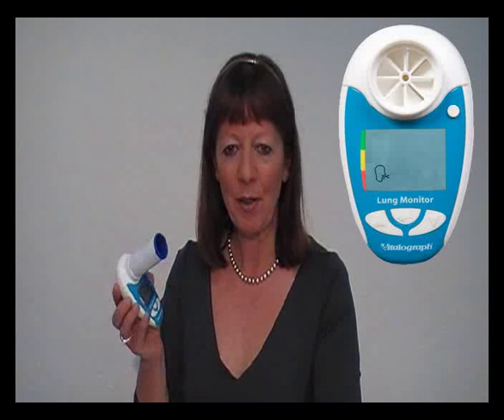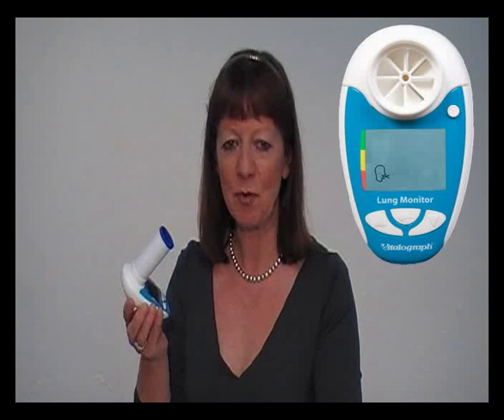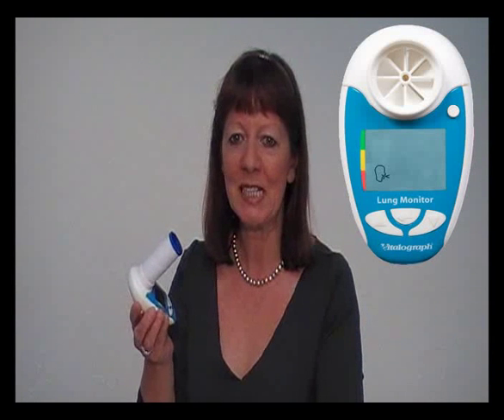Take a maximum breath in, lightly bite on the mouthpiece with lips sealed around it, and blow as hard and as fast as possible for at least 6 seconds.